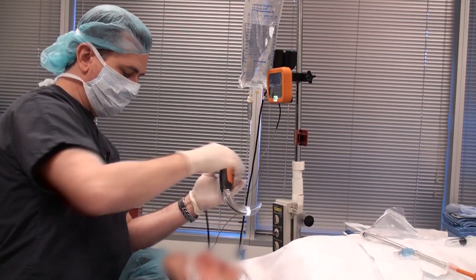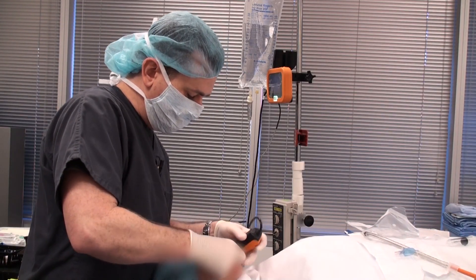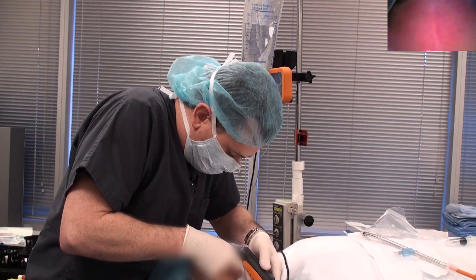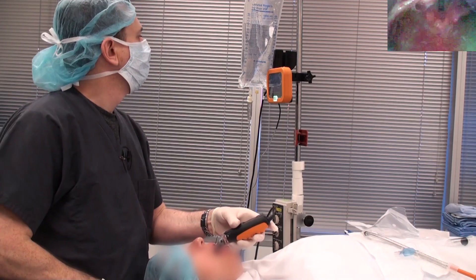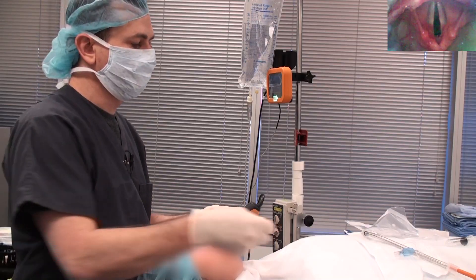The first thing you want to do is take your time and open the patient's mouth nice and wide. You want to visualize the tip of the sheath disappear behind the back of the tongue. Then we'll find the epiglottis, slide into the vallecula, and have a great view of the vocal cords.